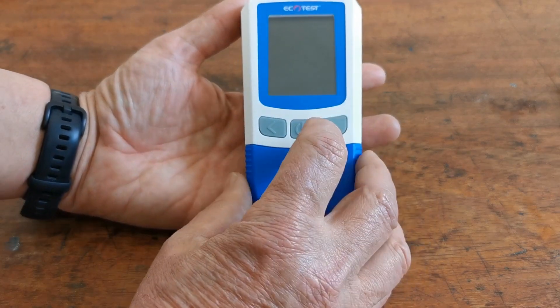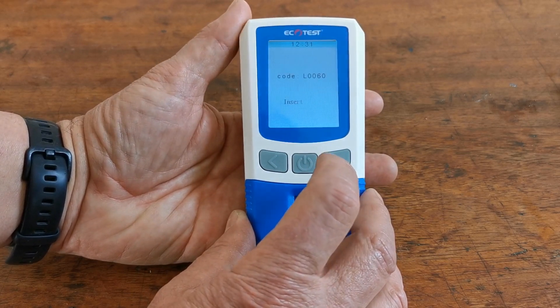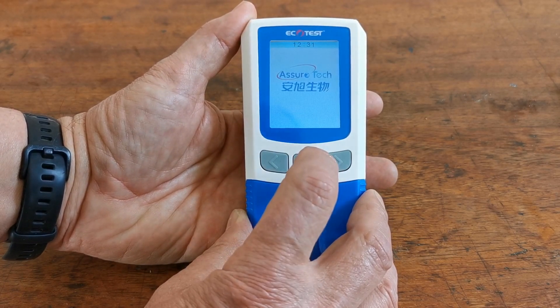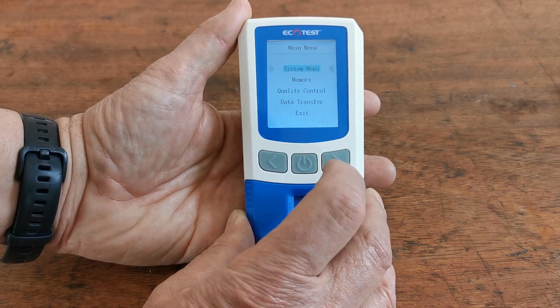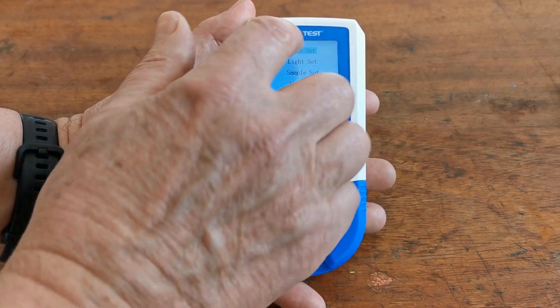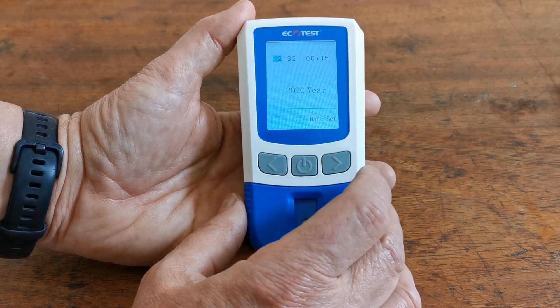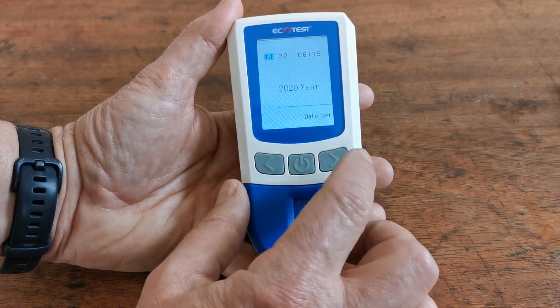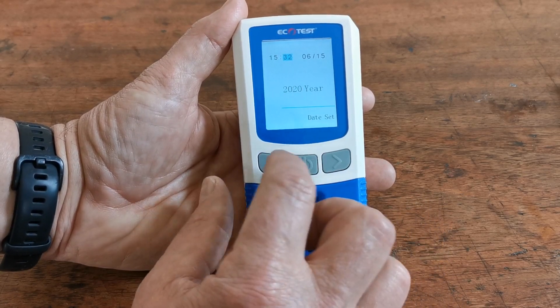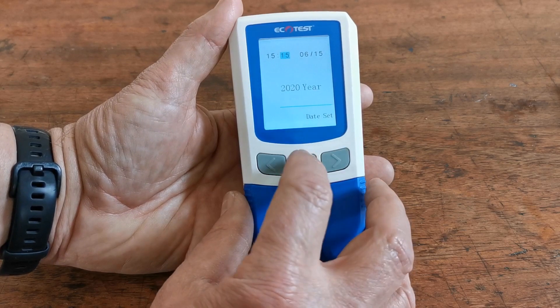When you're ready to set up the time and date — which we recommend on first initiation of the meter — depress the power button. Instead of proceeding to a test, press the power button again and hold for two seconds. This will bring up the system menu. Navigate through the system menu to date set and press the button again. It will ask you to set the hour — use the arrow buttons to adjust up or down. I'm going to set it to 15:15 for quarter past three.